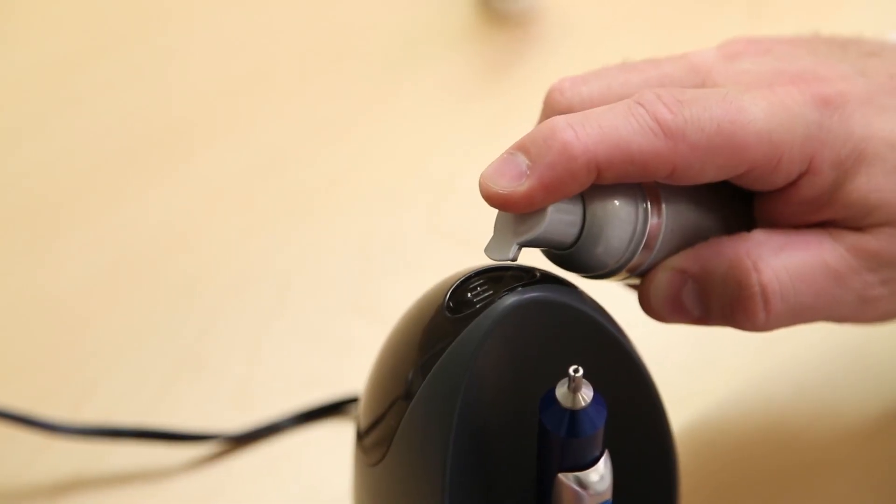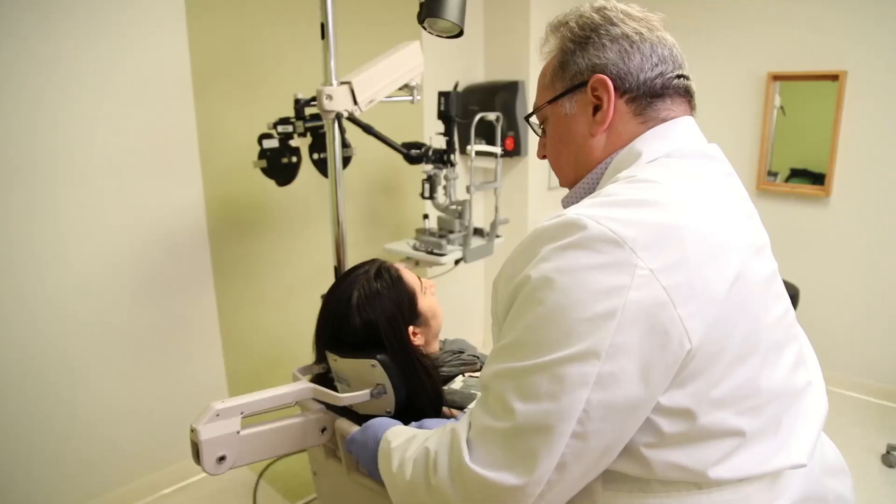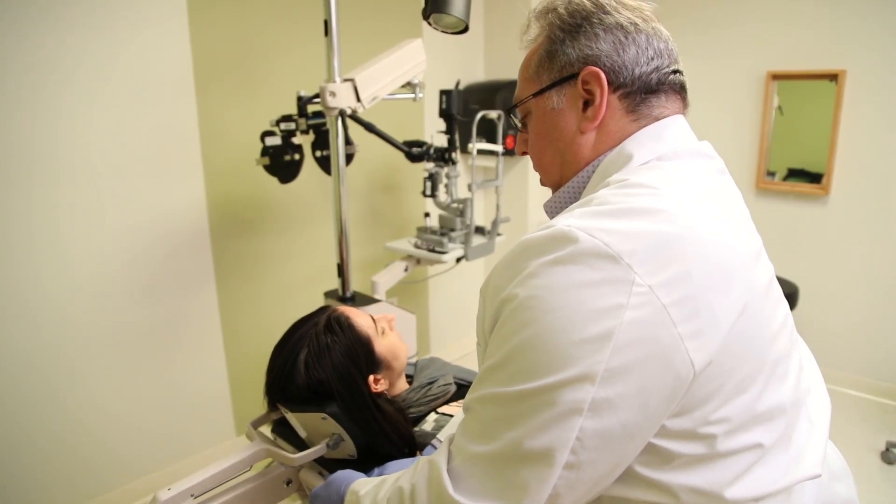Allow it to dry completely. Fill the reservoir with lid cleanser. Usually one or two pumps is sufficient.